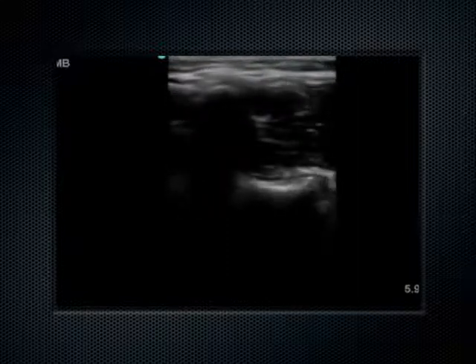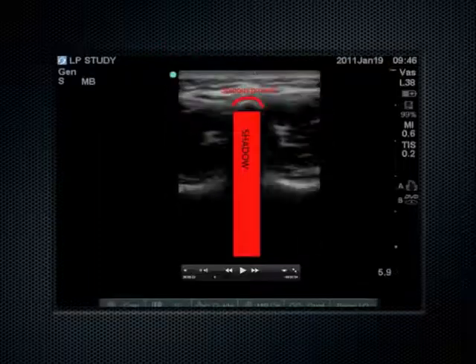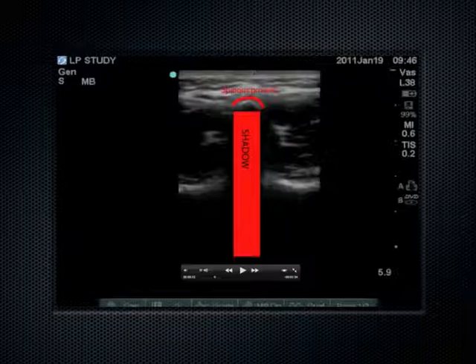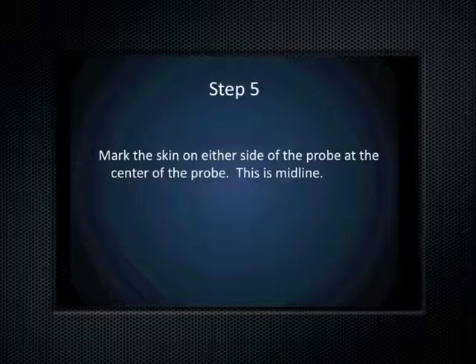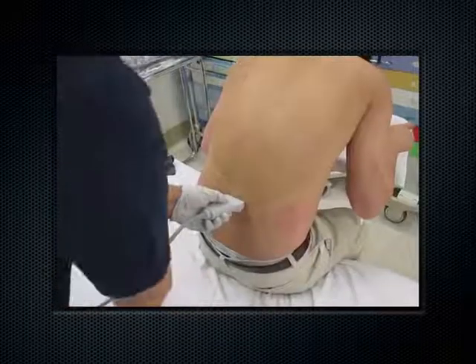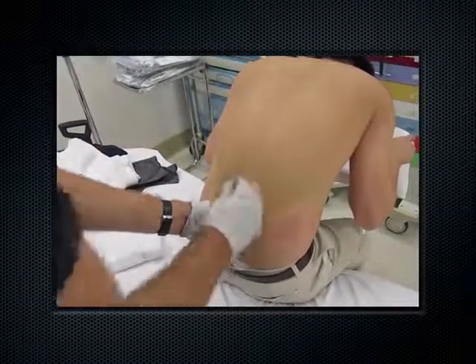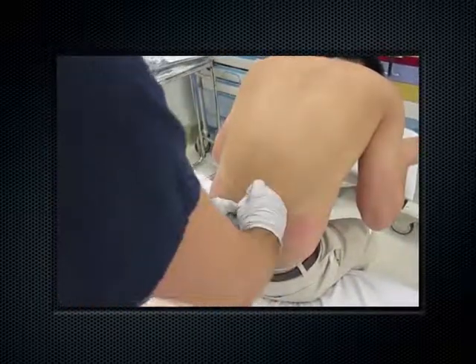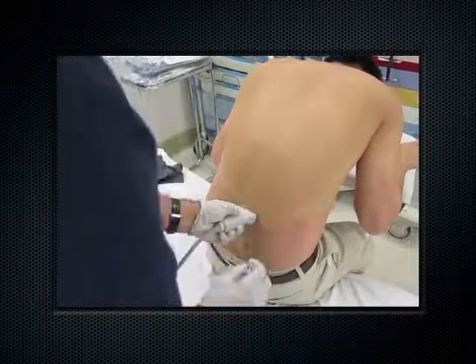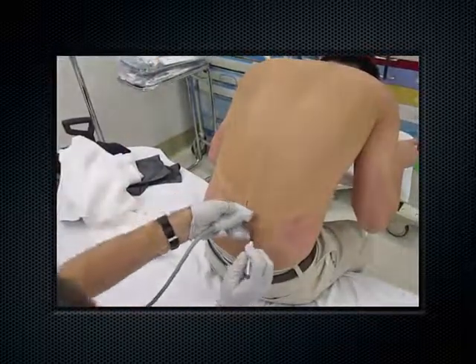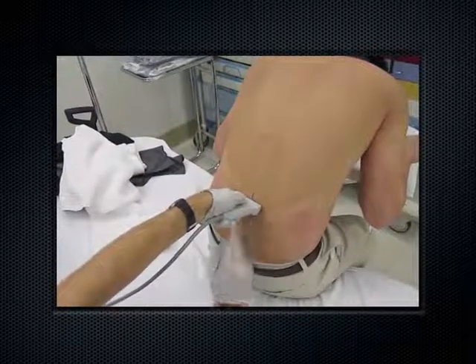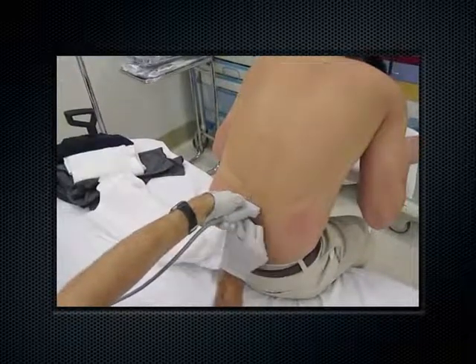The spinous process will appear as a hyperechoic rim with shadowing behind it. You may need to make small adjustments up, down, and side to side with the probe to get this image centered. Once you have found the spinous process centered on the ultrasound screen, make two skin marks on the patient's back right in the middle of the probe on either side. When the probe is removed, these two marks tell you where midline is.